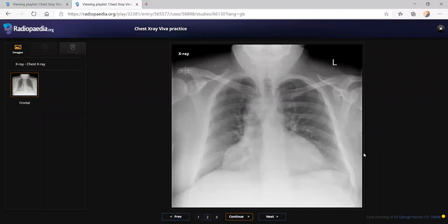There seems to be some sort of dense or calcified tubular opacity. Can you show me the aortic knuckle? I think the aortic knuckle is here, that's left-sided. However, there is this oblong opacity, which is merging with the heart. And there seems to be a dense or rather calcified tubular opacity in the right retrocardiac region. The lungs appear grossly unremarkable, and I do not see any discrete sclerotic or lytic lesion.